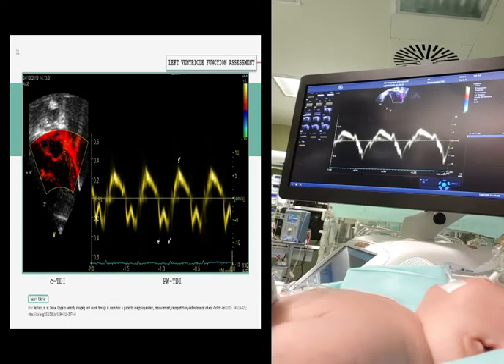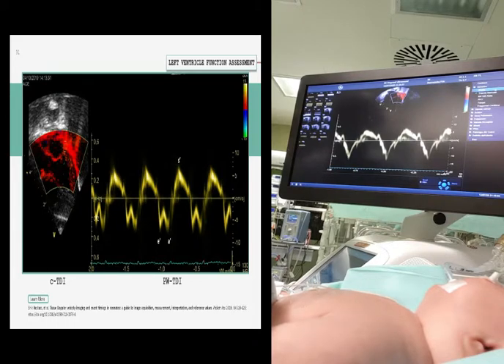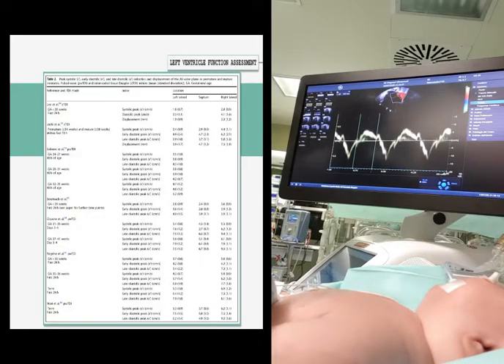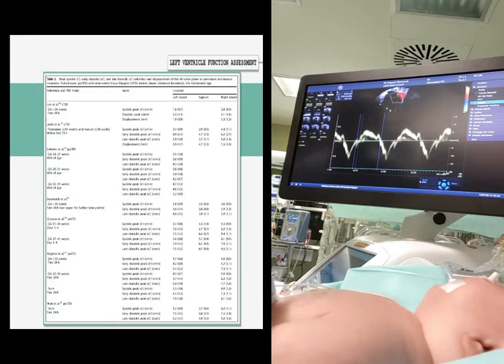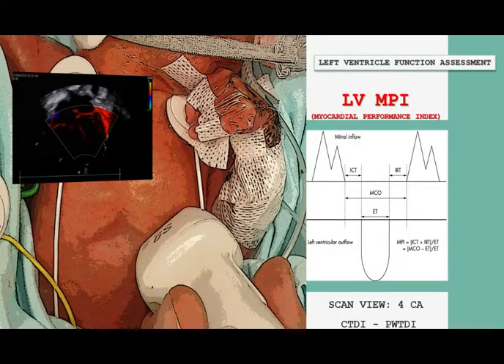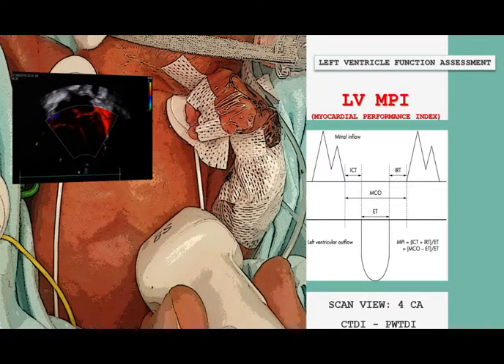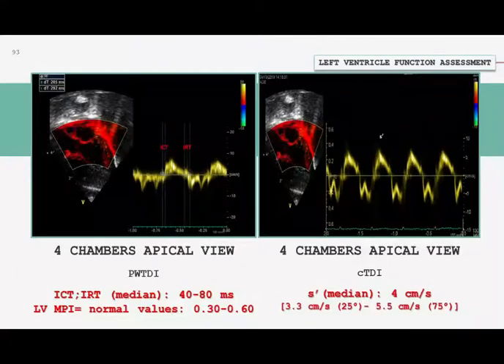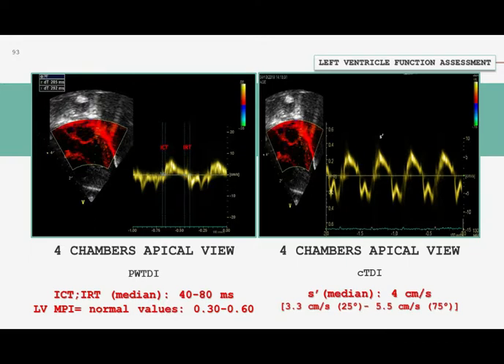The spectral above the baseline, S, shows movement of myocardium during systole, while E and A waves below the baseline show diastolic movement of myocardium. Several studies describing reference ranges of tissue Doppler velocities and displacements from the apical four-chamber view in premature neonates and term neonates have been published. This technique allows for the measurement of the left ventricle myocardial performance index, not influenced by heart size and geometry, which can be derived by dividing the sum of the systolic isovolumic intervals by the time of systolic ejection. Left ventricle myocardial performance index average values reported in neonates are 0.3 to 0.6, and this index decreases with gestational age, with maturation, and with reduced load.